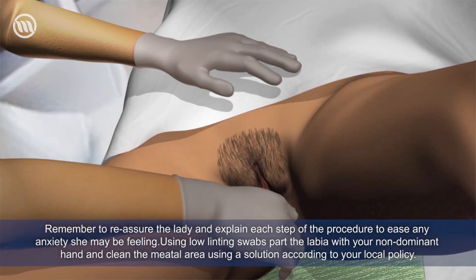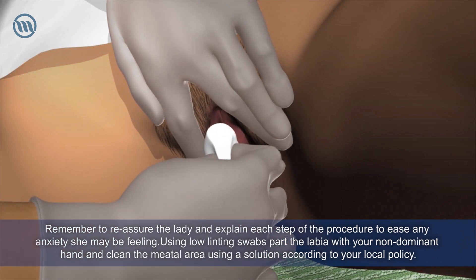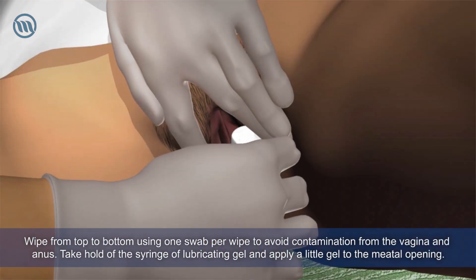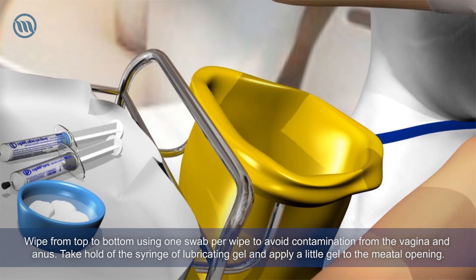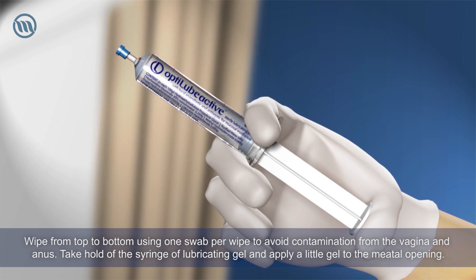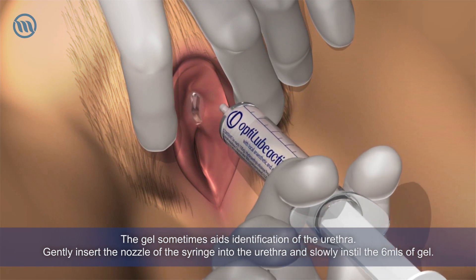Using low-linting swabs, part the labia with your non-dominant hand and clean the meatal area using a solution according to your local policy. Wipe from top to bottom using one swab per wipe to avoid contamination from the vagina and anus. Take hold of the syringe of lubricating gel and apply a little gel to the meatal opening.